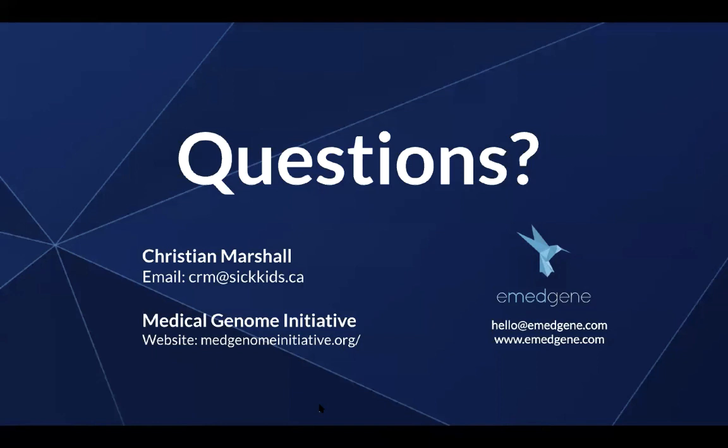Yeah, and I would be remiss if I didn't mention the paper, especially the NIST group, the GIAB, I think have come up with some really good standards, and of course Justin Zook's work. So I didn't show the data today, but this is what we are working on now. I would recommend using it as a benchmark. You can use NA12878, but I think the Ashkenazi Jewish offspring is probably a more complete benchmark, and I would recommend using it. I still think there are some holes in it, but it's probably one of the better standards that you're going to get out there right now. So I do recommend using that.